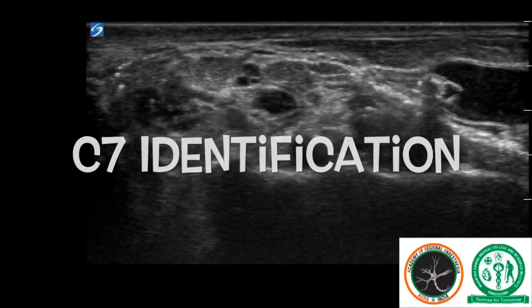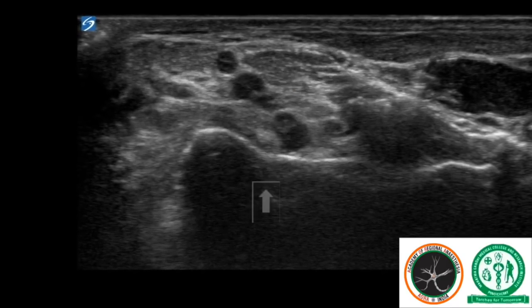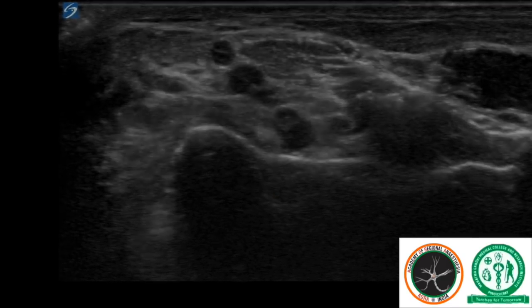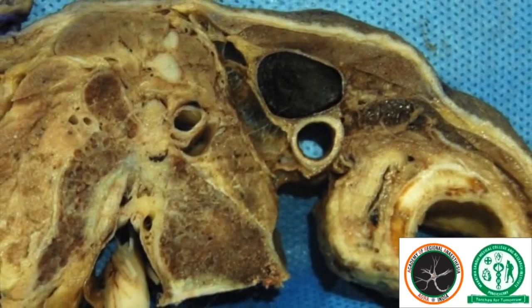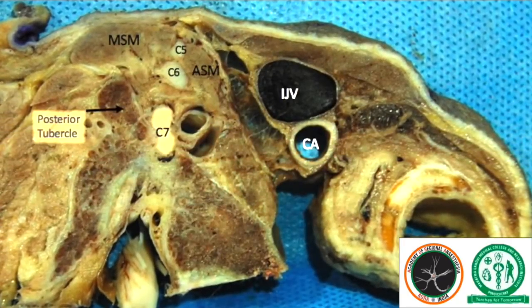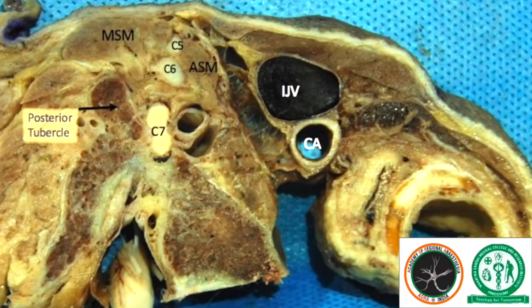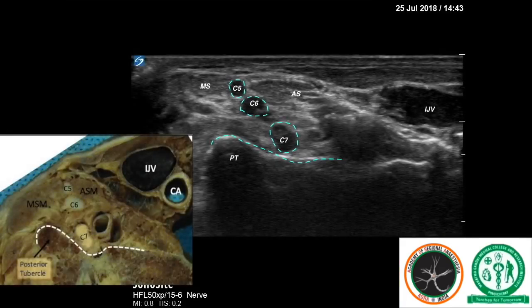At the C7 level, our assumption was that the C7 root appears over the flattened transverse process of C7. Actual anatomy revealed this to be true. The single, hypoechoic, round structure is the C7 root on top of the C7 transverse process, which has only a posterior tubercle.